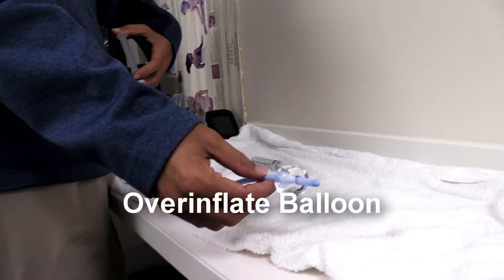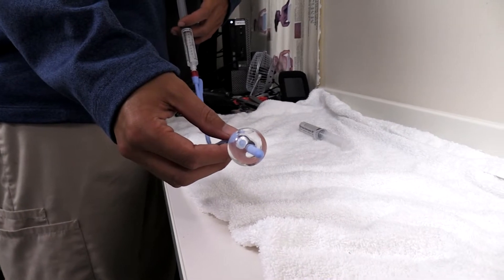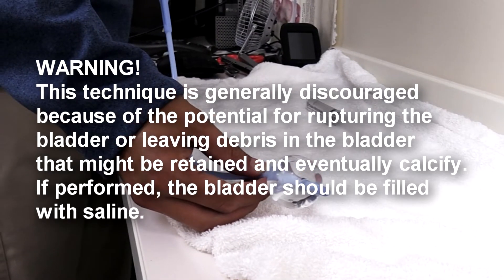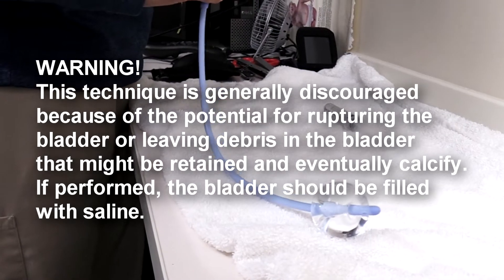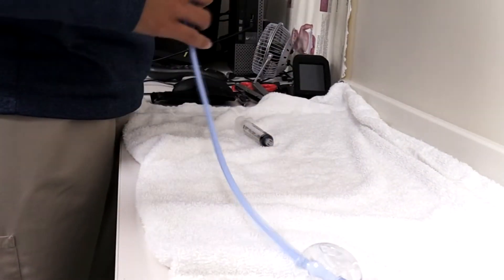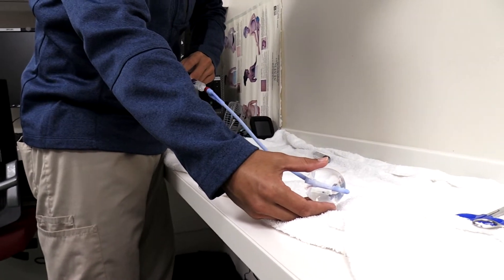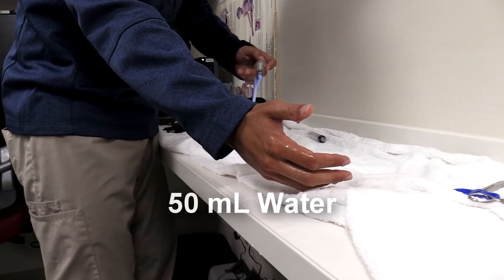So we filled up two more syringes of 10ml to see how much it would take to actually pop this balloon. We're going to need to fill more water from the sink — we're now getting up to 40ml total.